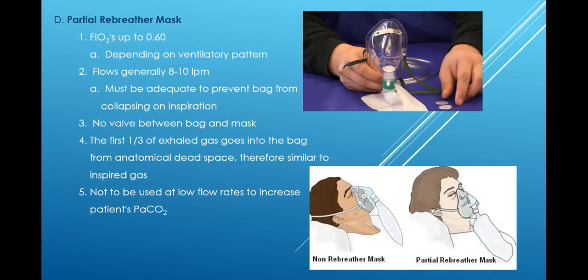So if I exhale, my first third of my exhale goes down into the bag. So that means when I inhale, that same 1/3 comes back to me. So I'm rebreathing some of my breath. That's why it's a partial rebreather mask. I partially rebreathe some of my exhale gas, okay?